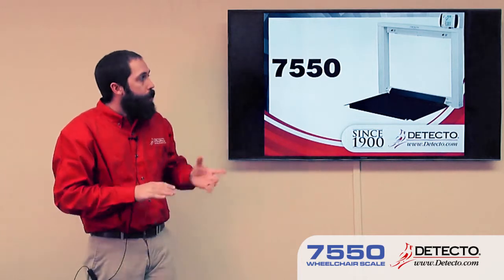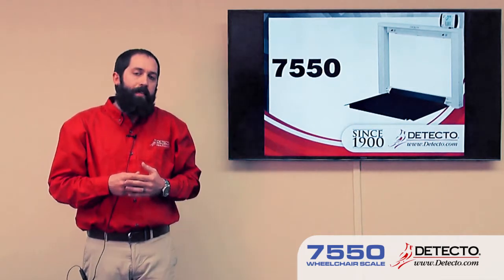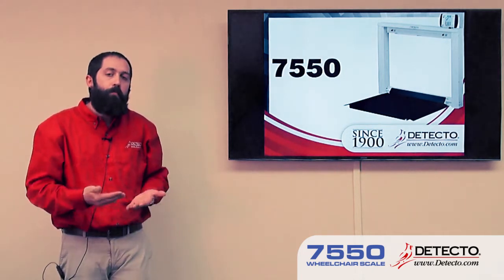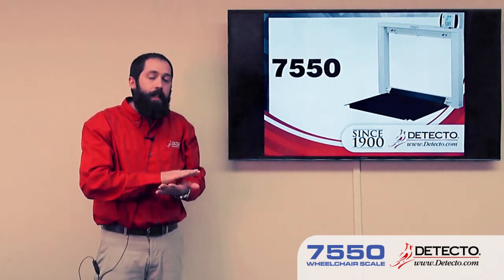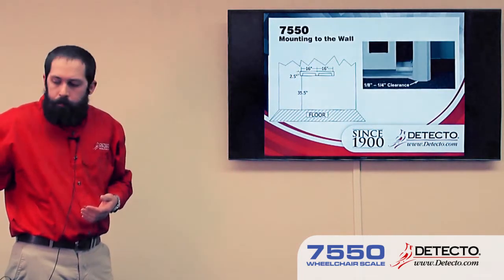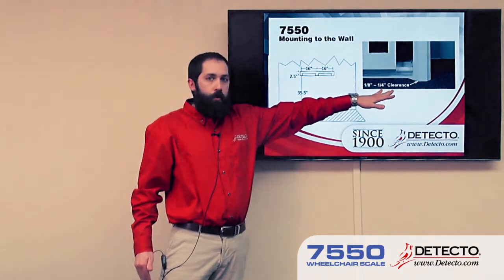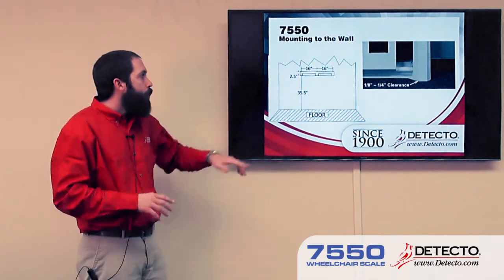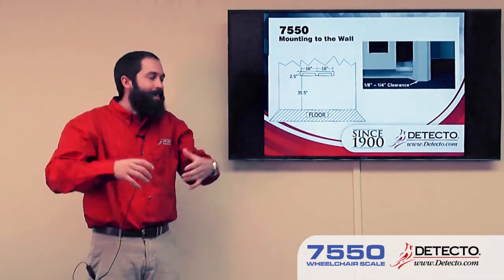Another thing about this scale — you'll notice on either end of the platform there's kind of a larger column. Those columns have gas cylinders in them. Those assist in the raising of the platform so the user doesn't have to lift the full weight of the platform. It also helps when bringing the platform down so the platform doesn't accidentally get dropped and damage the load cells. The 7550 does mount fully to the wall, where there's supposed to be a quarter to an eighth of an inch gap at the ground. It's mounted completely by a bracket — the bracket mounts on the wall, and then the scale hangs inside that bracket.